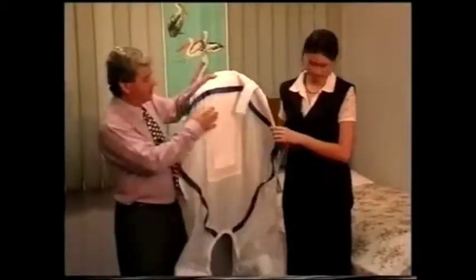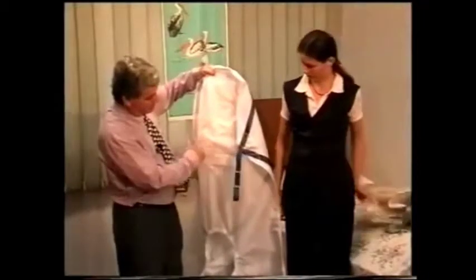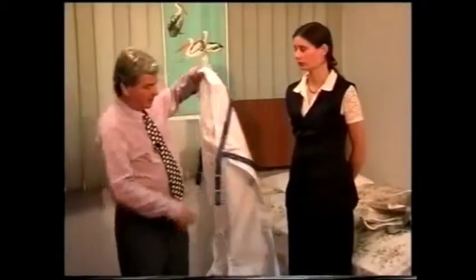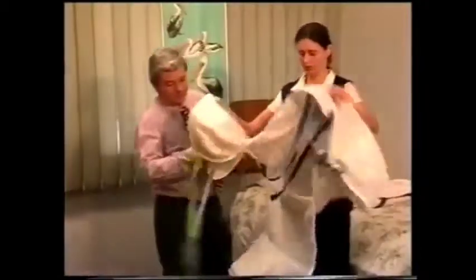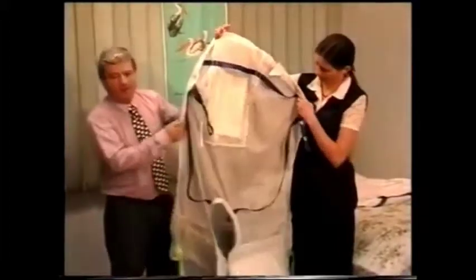We've got padding in the head support here as well, and there's a row of stitching down the middle here so that when you fit the sling, you can see that you've got it lined up with the centre of the spine at the back there. So I'll get a chair ready, and here, yes, we've got a netting sling. This is the same design, only in netting.